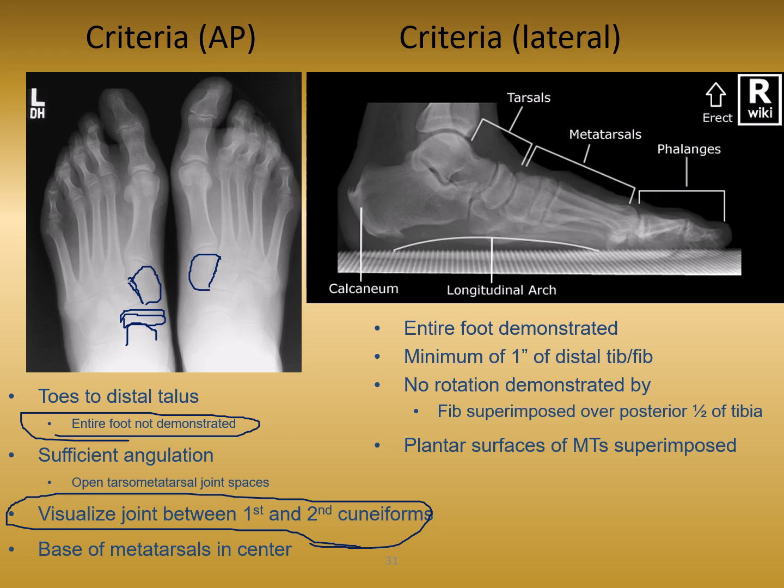and you don't want to change that because the doctor is going to assess that natural curve and arch of the transverse arch that's happening on that patient when they stand. So they really want to see that. They want to see any type of abnormalities that occur when they're just standing straight up. That's basically the whole purpose of that exam. On the lateral, we are looking for the longitudinal arch.